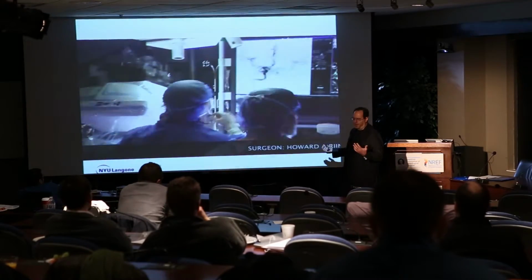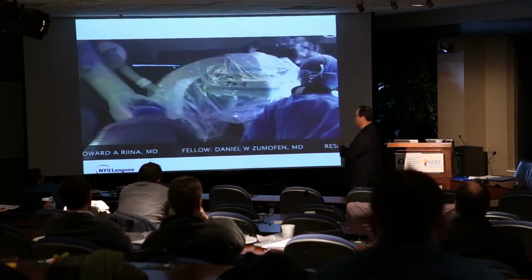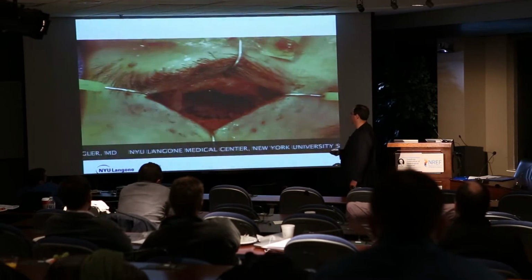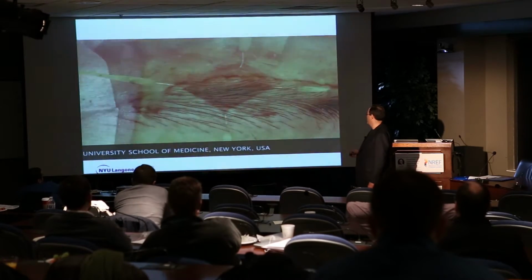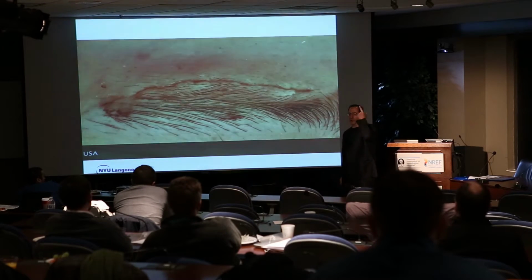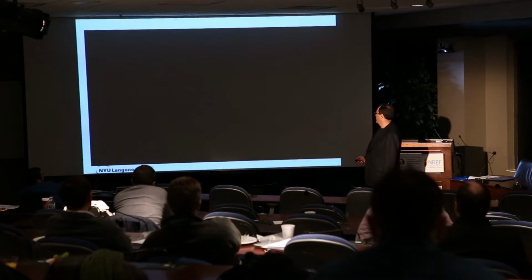So in this case, obviously I didn't do indocyanine green, just because we have this fantastic piece of equipment. And then you just pull it out and close. The closure takes a couple of seconds. You close the dura, pop a little piece of bone back in. Sometimes you use a little methyl methacrylate to smooth out the bone, but that's the incision. It's a little nothing. These patients go to the recovery room with a Band-Aid. Almost all of them go home the next day. It's like a 23-hour mission, just like a carotid. So let's look at another video.